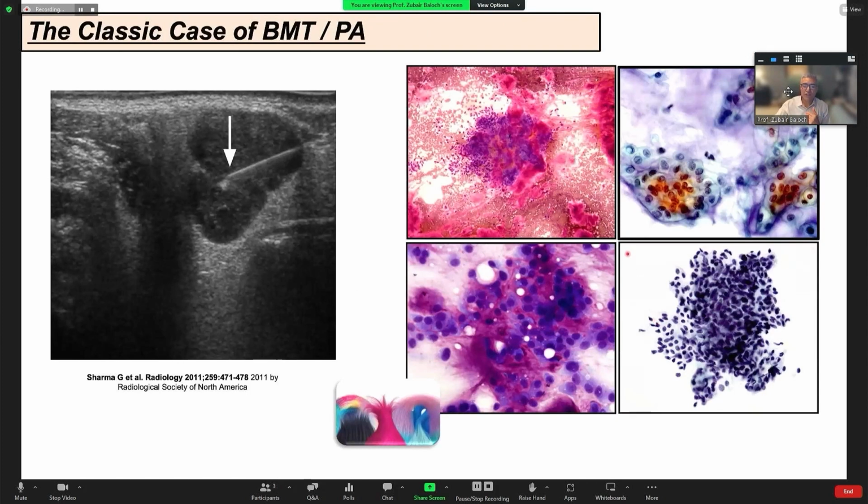This is one of the cases that I always show, which is a very important case. You can see on radiology, this is a very circumscribed tumor. This is where the needle is. There is really no infiltration on the surrounding edge, so it's a very low risk neoplasm. Most commonly, this is going to be a picture of a pleomorphic adenoma. It's very hypoechoic. That means it has cells and stuff which let the ultrasound waves go through it and not cast much of a brighter shadow.